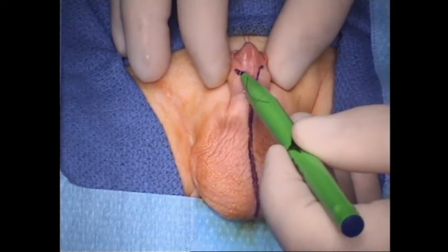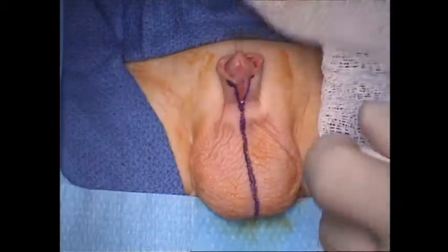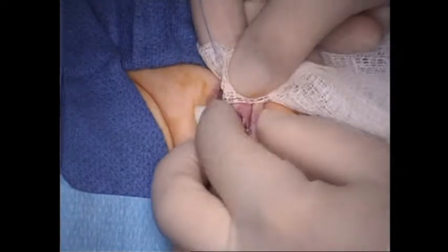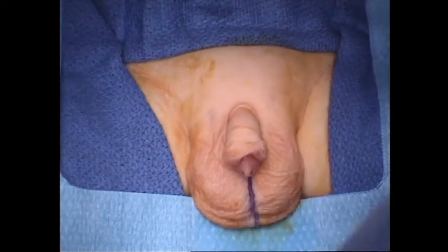Now, right here, we're going on either side of the urethral plate, and we're making sure to leave enough mucosal collar right here underneath the glans wings, because it looks really odd if you're going to circumcise a patient and you don't have a mucosal collar.